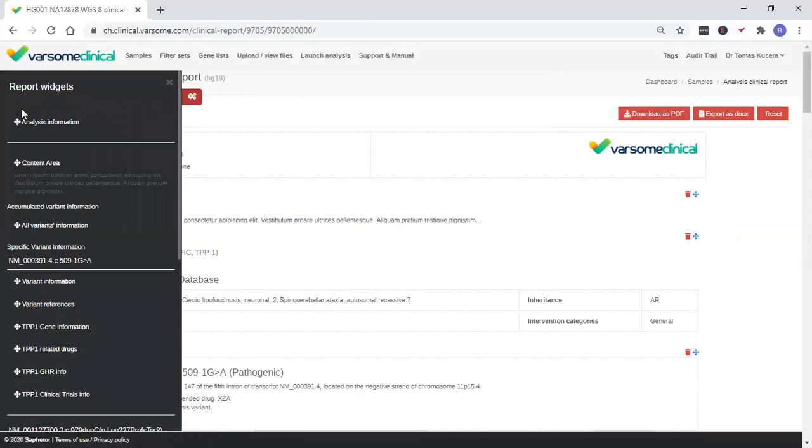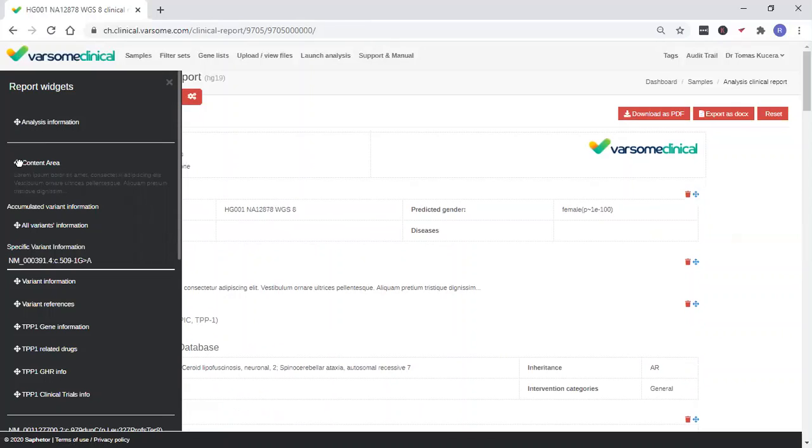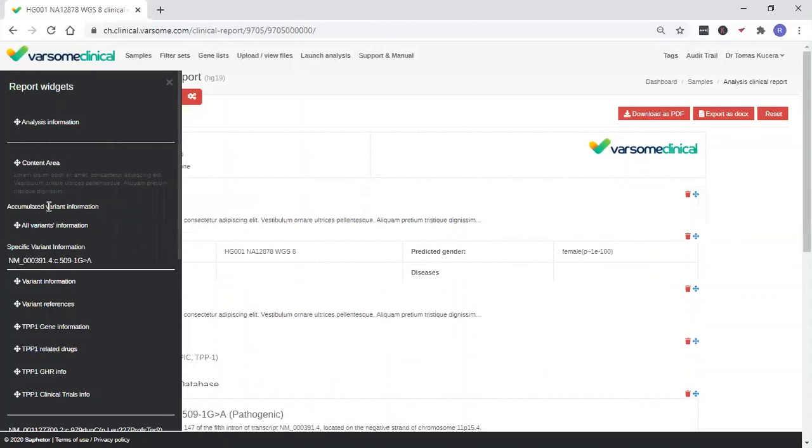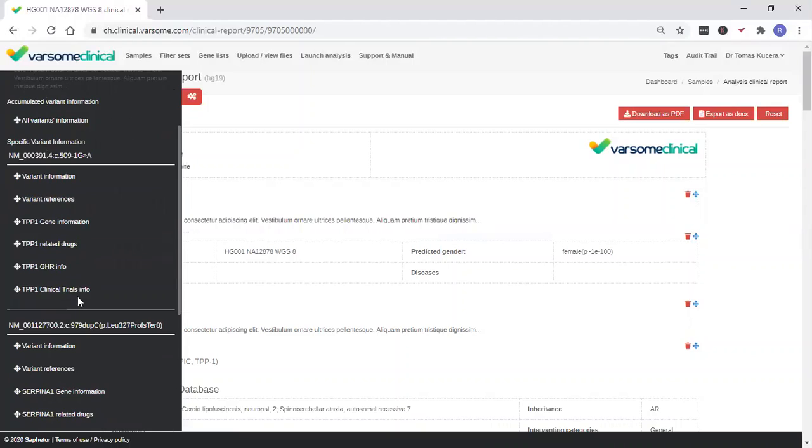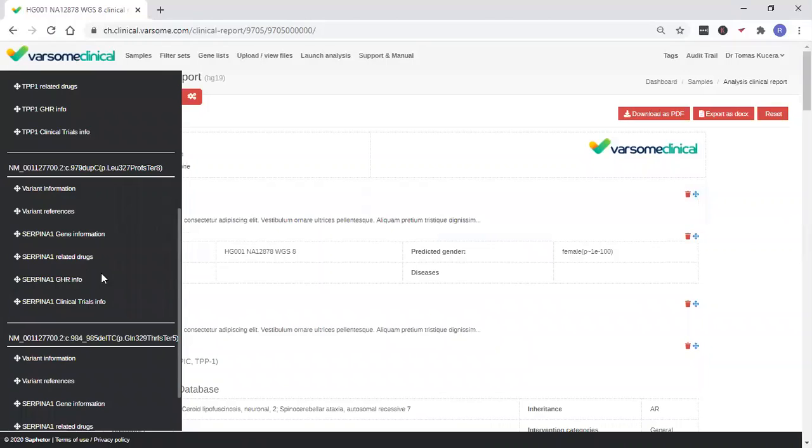The widgets are pieces of data and this functions as a drag and drop menu. For example, you can drag the analysis information here as well as the content information. Information relevant for genes, a list of drugs, information related to clinical trials, etc.